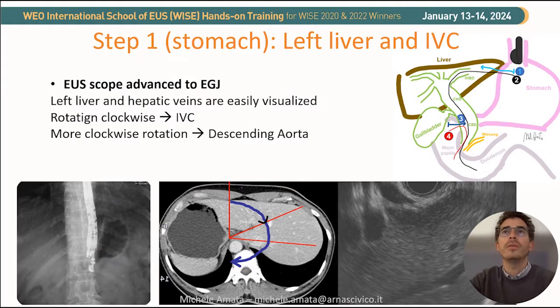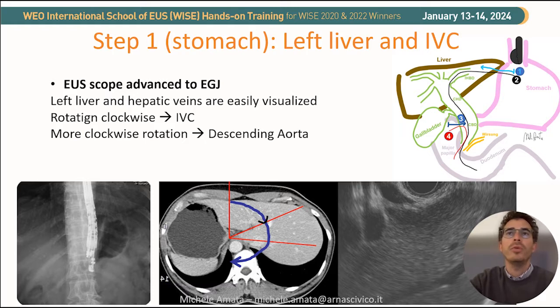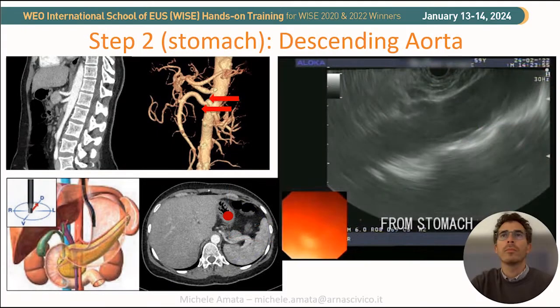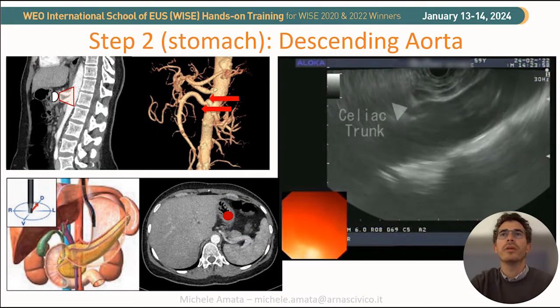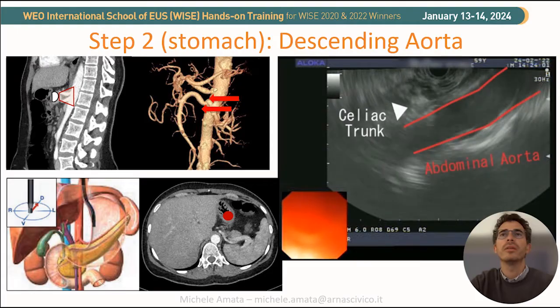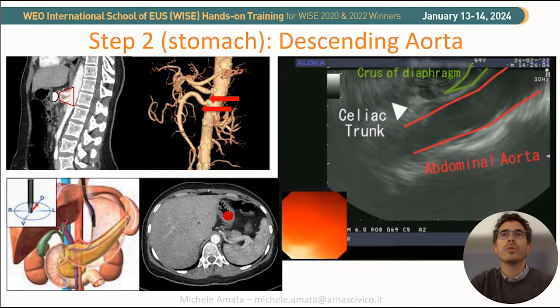As you see in the fluoroscopic picture, as we advance the scope to the EGJ, the transducer is usually facing anteriorly, looking at the left lobe of the liver. Then you need to turn clockwise to let the transducer face the aorta posteriorly. Looking posteriorly, we will observe the aorta, the celiac trunk, and the superior mesenteric artery. We need to distinguish the crus of the diaphragm.